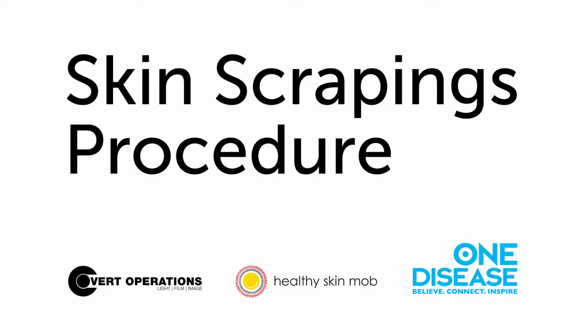The skin scrapings procedure is a clinical diagnostic tool undertaken to identify evidence of Sarcoptes scabiei, the microscopic mite that causes scabies. A skin scraping of mites is required in the Northern Territory under the Notifiable Diseases Act for the correct diagnosis of crusted or Norwegian scabies.